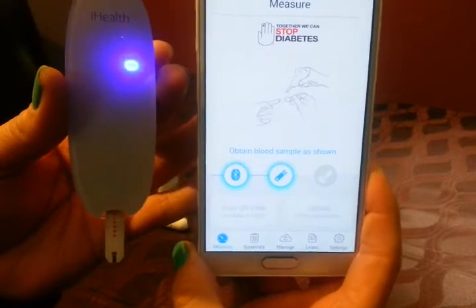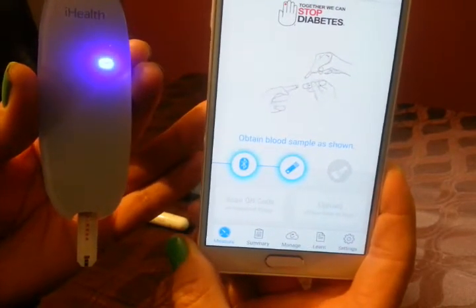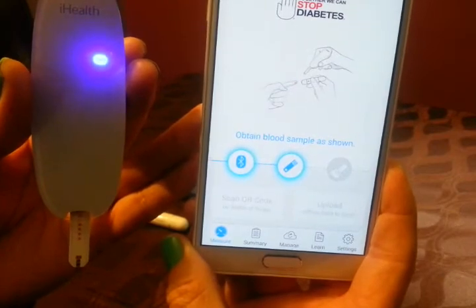As you can see, the light turns solid. The phone is responding to it, and it says 'obtain blood sample as shown.'